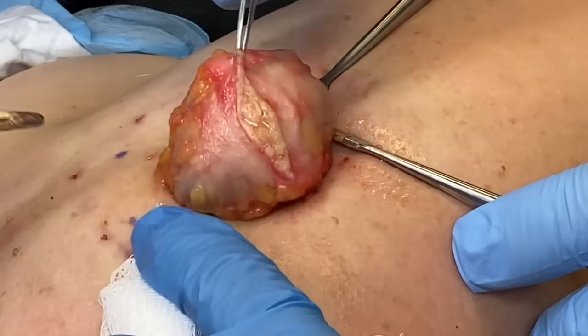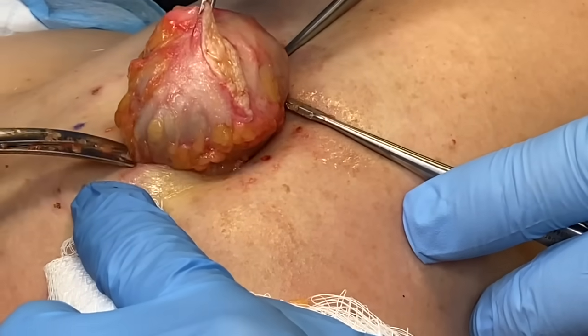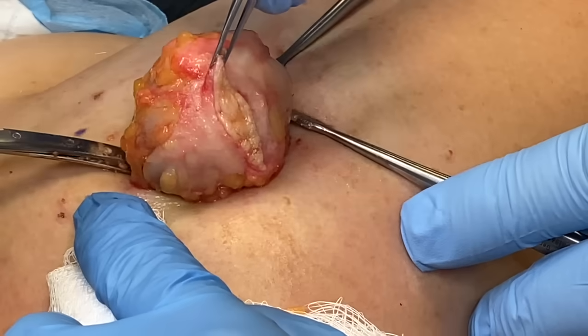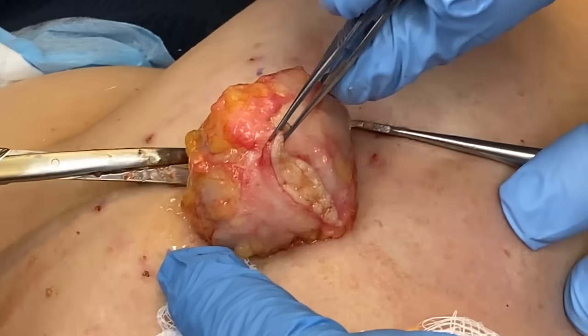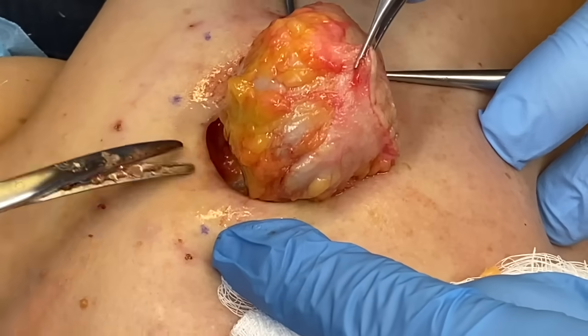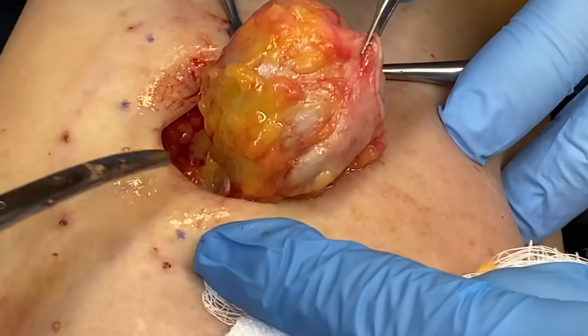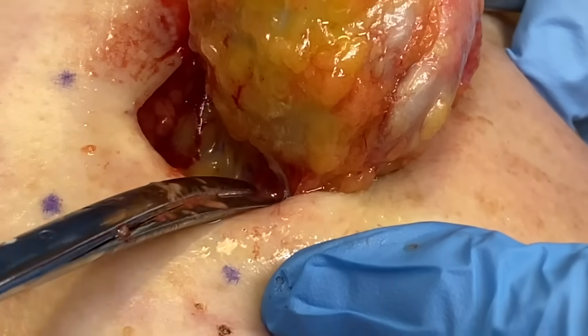Well, this is just the difference. Like I said, you could easily have ruptured this and maybe saved yourself a couple of minutes. But now we'll have no doubt. See how I'm right behind it now? Now it's easy. This is why I'm saying, if you just take your time with it, it's certainly a bit of a headache. See those adhesions? This is what adhesions look like behind a cyst. This is what we're just breaking down here.